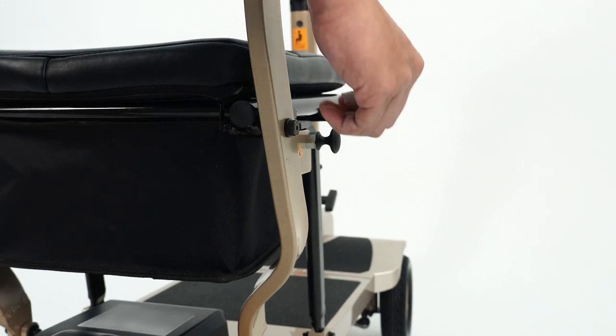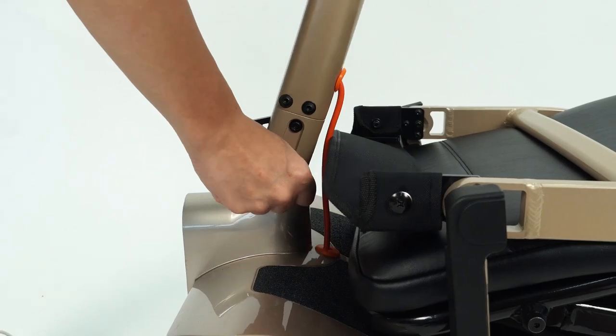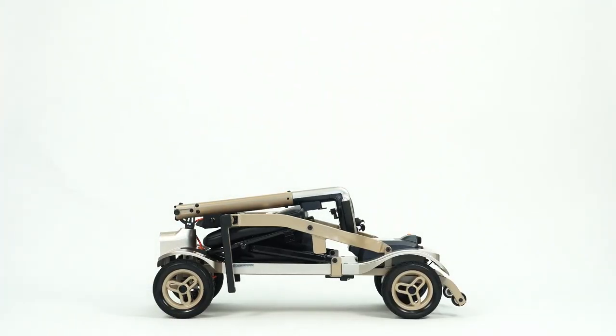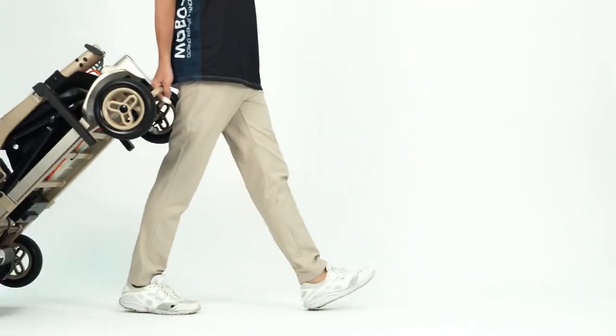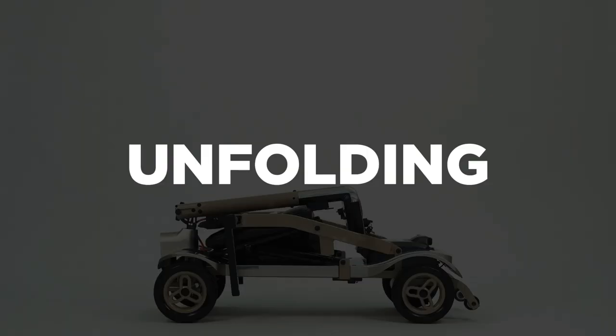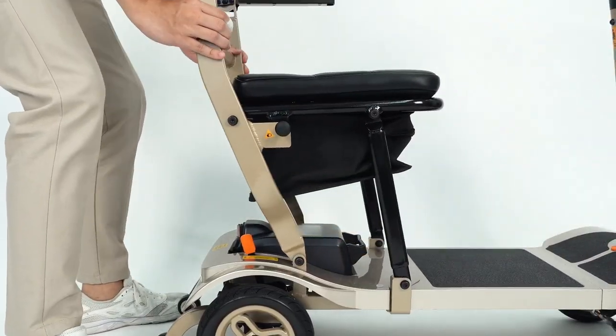Folding: First, pull the knob and push the seat down. Next, pull the front knob and pull the handlebar down. When the device is folded, you may use the front handle to transport it using the trolley wheels. Unfolding: Pull the knob and lift the handlebar up, then pull the seat back up.